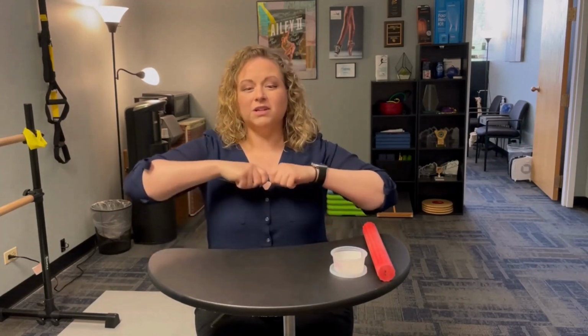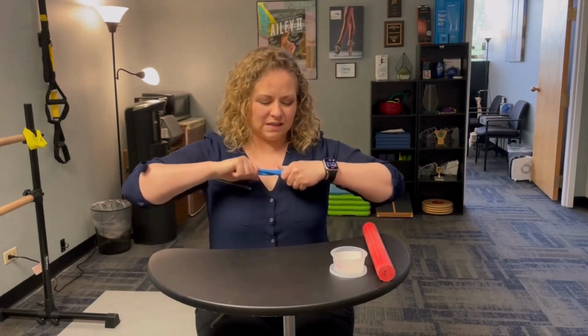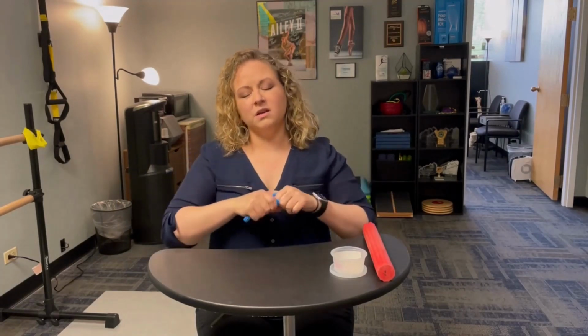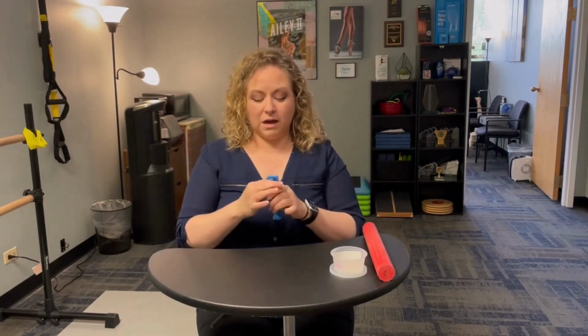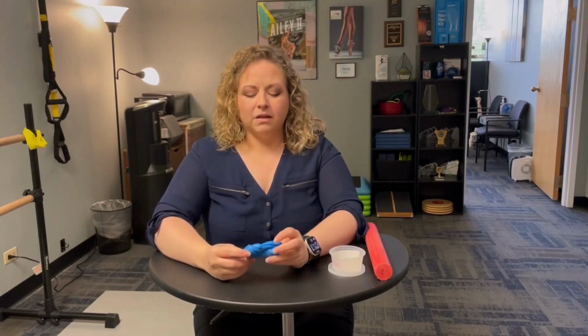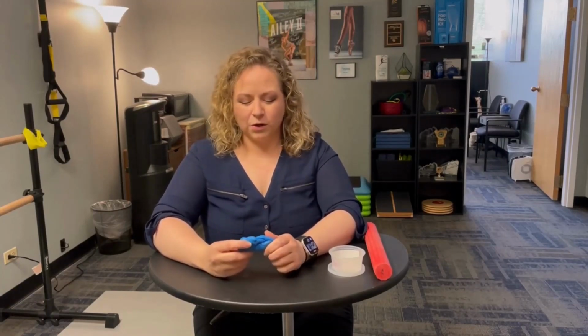But what we're going to do first is we have to warm up the putty. When it's just sitting in the container, it gets really stiff and difficult to work with. So at first, I'm just going to work on warming it up. Mine is also a little dried out at this point, so it doesn't behave quite the same, but you'll get the idea of what we're wanting to work on. With all of this, these are just some suggestions of what you can do, but there are lots of different things that you can try that can all be effective for you.